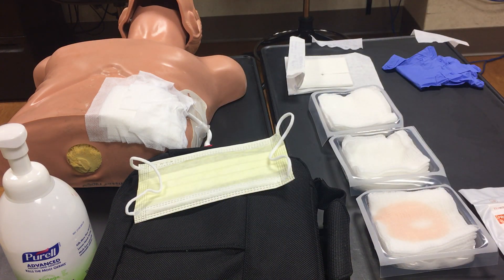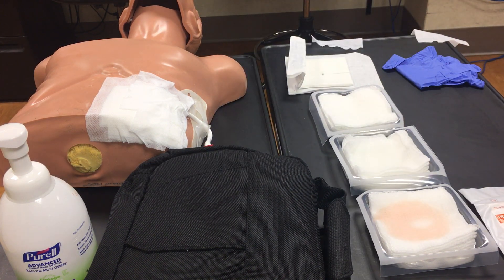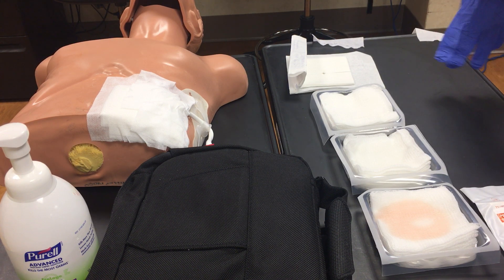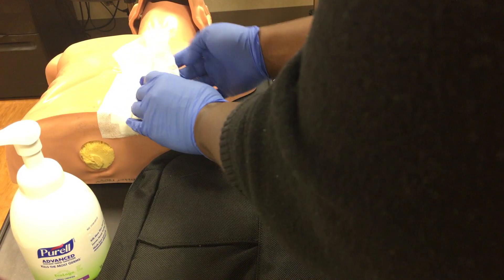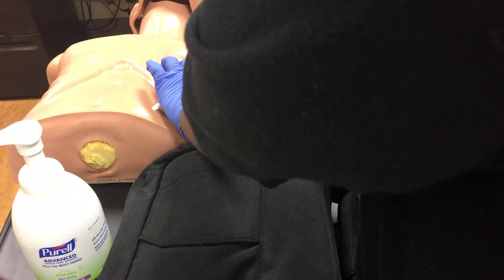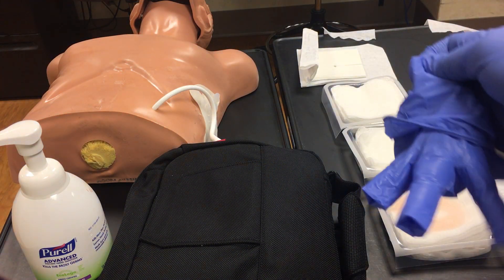Next, put on your mask and put a mask on the patient. Then put on your regular gloves and remove the current dressing from the patient, being careful not to tug on the driveline. Once the dressing is off, take it out of the anchor so you can clean the driveline properly. Remove the regular gloves.